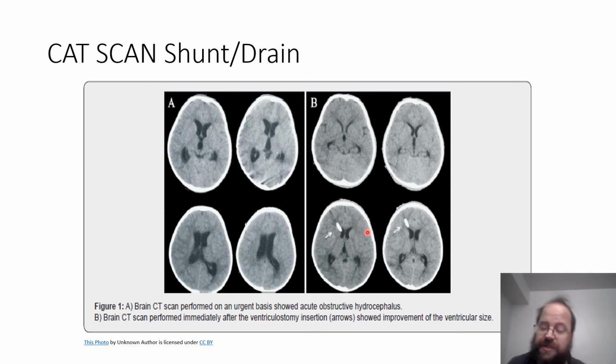The important thing to understand is you're still kind of limited to what you can see in a CT image. For as good as they are and useful as they are, they're good for finding things that are emergent. You can follow up with a patient, and many doctors' offices have small CT scanners and things like that, but there are a lot of limits.